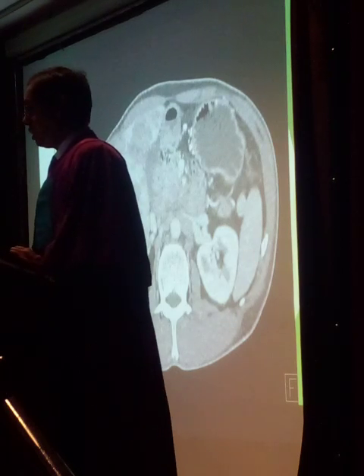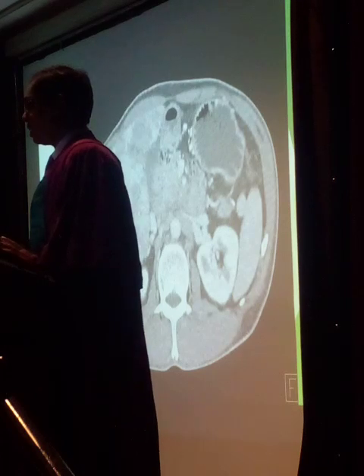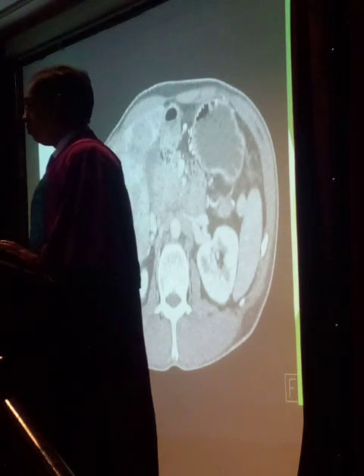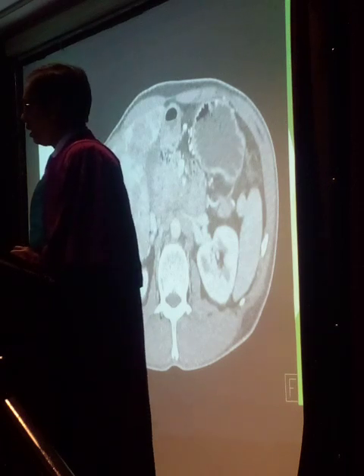So the next one, I should say, is the radiological involvement. We can use ultrasound and CT for biopsy of pancreatic carcinoma. If we can access it by ultrasound, we can get the biopsy by going through the stomach, or around the margin of the stomach or the peritoneal part. Or if we can't access it by ultrasound, we can use CT to access it for biopsy.